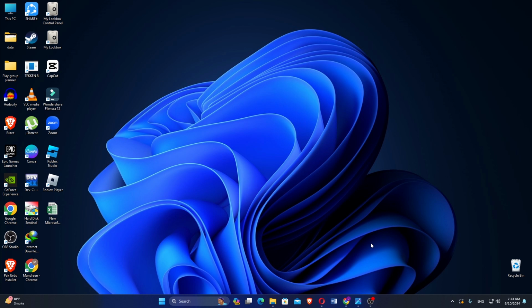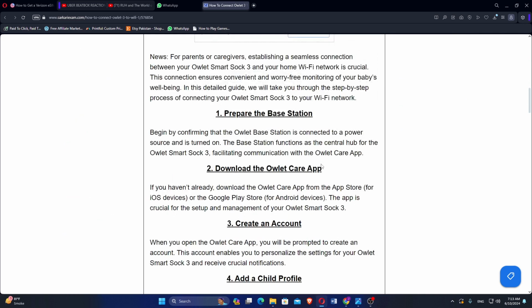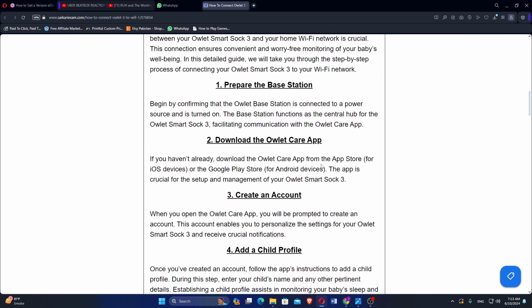Hello everyone, in this video we will see how to connect the Owlet Smart Sock 3 to Wi-Fi. Begin by confirming that the Owlet base station is connected to a power source and is turned on.